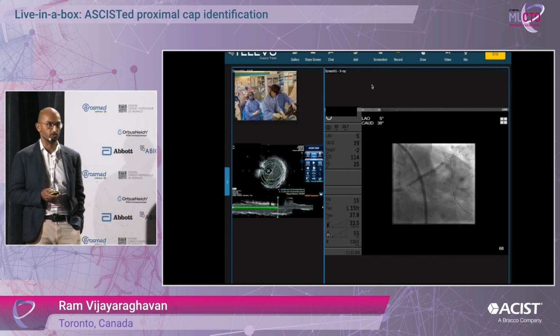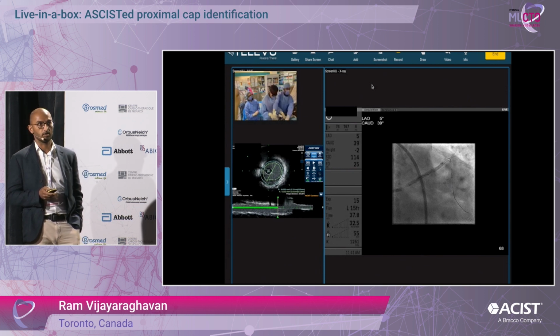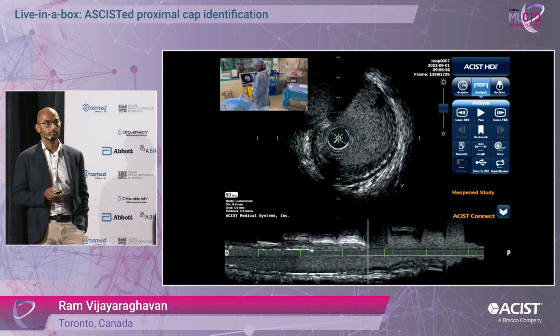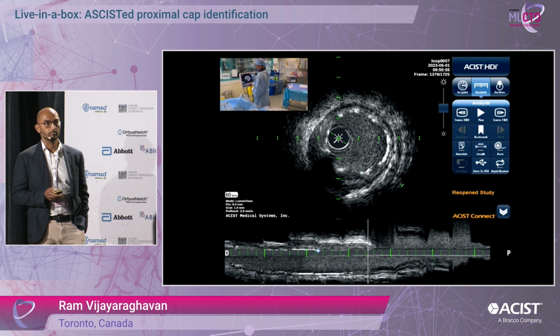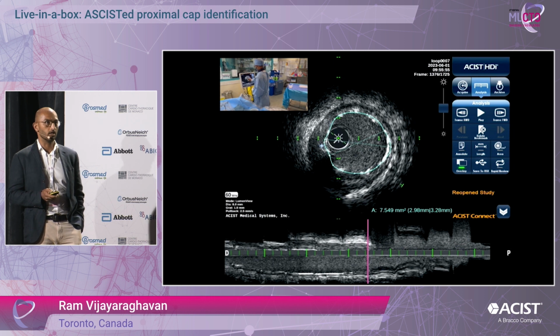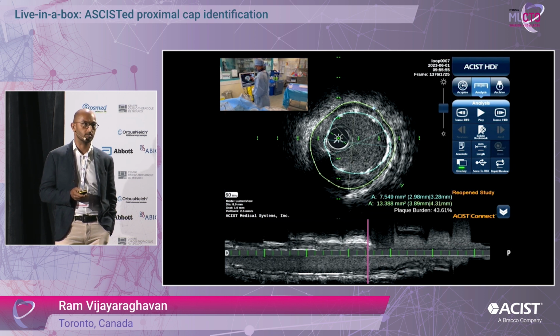So here's our stent placement. We've chosen a 12 and 38 millimeter everolimus eluting stents, 3.0 and 3.5 respectively, and we're deploying those. And of course, at the end, we have to check our stent result. So it's not acceptable just to put it in. We have to finalize and ensure that we have adequate lumen. So despite the fact here that we're ostially greater than 30% plaque burden, I would say we have a pretty good result with excellent stent expansion over 7 millimeters squared at the ostium of the LAD. So that is not likely to cause us problems in the future.